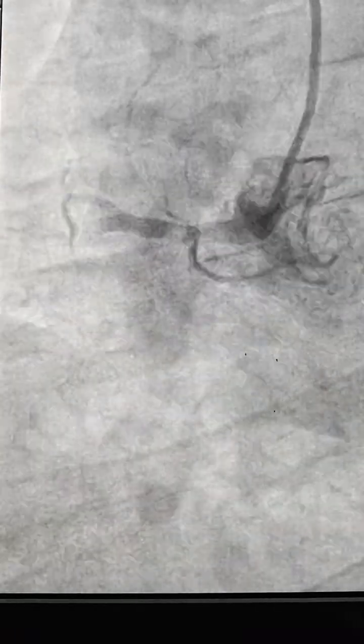So it is very difficult in a chronic smoker patient. There are chances of no-reflow and all. So after explaining all the risks involved, we proceeded for the angioplasty. After all clearances, you can see how bad the engagement is, and there is an anomalous origin of the RCA.